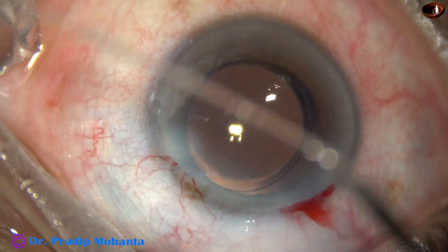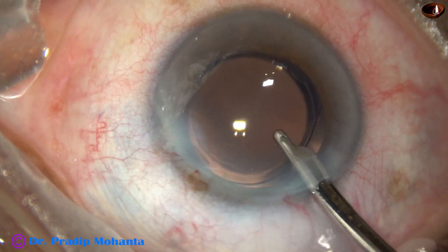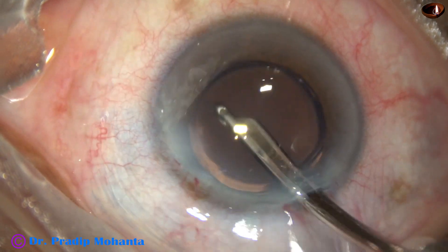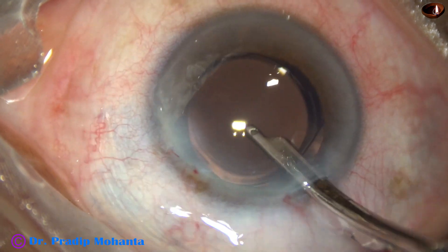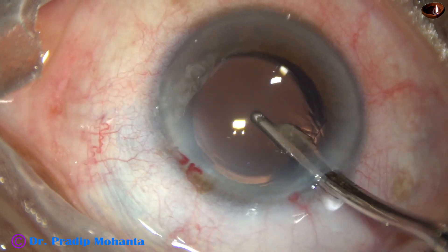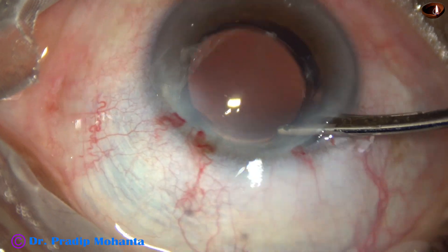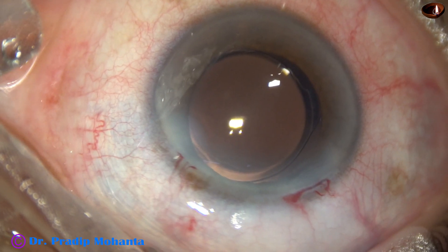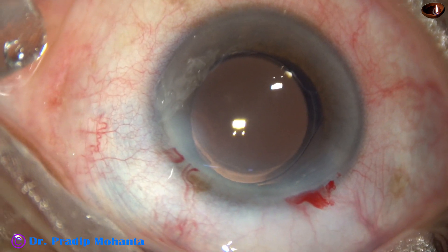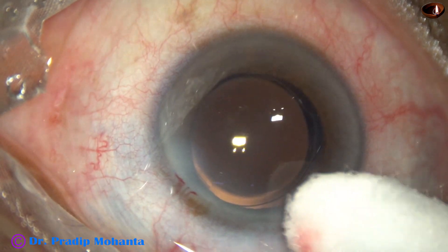The side ports are closed by hydrating corneal stroma. Final lavage of the anterior chamber is done. The anterior chamber is formed very nicely, integrity of all the wounds is checked, a few drops of moxifloxacin are applied over the ocular surface and the case is concluded.